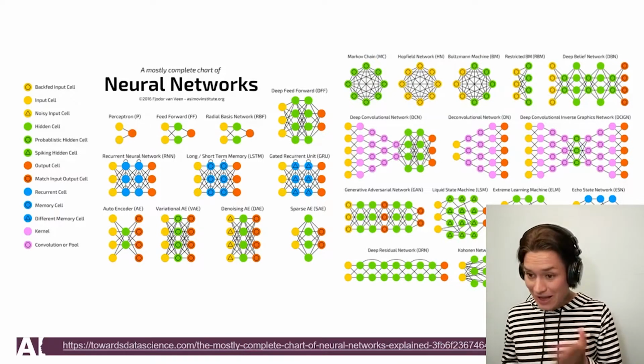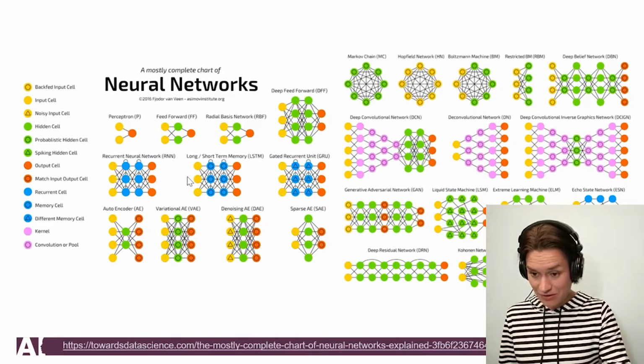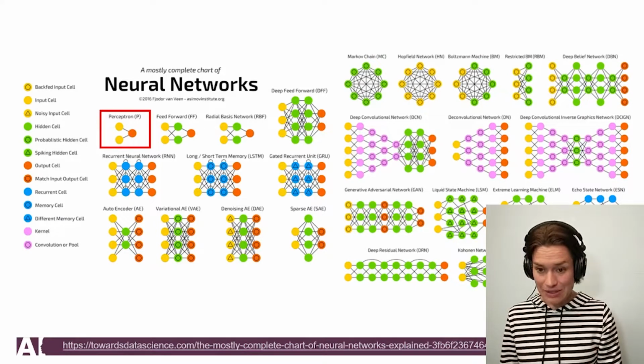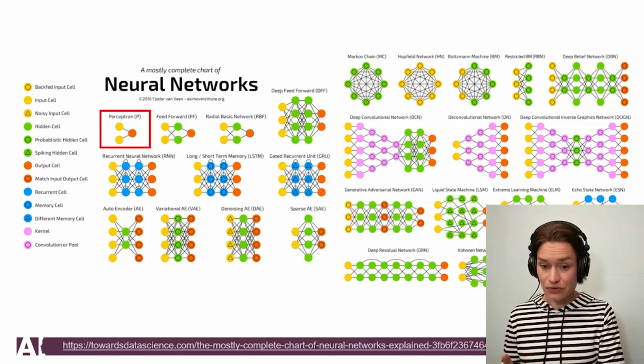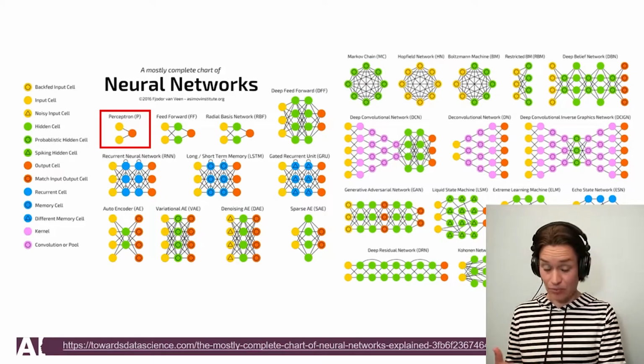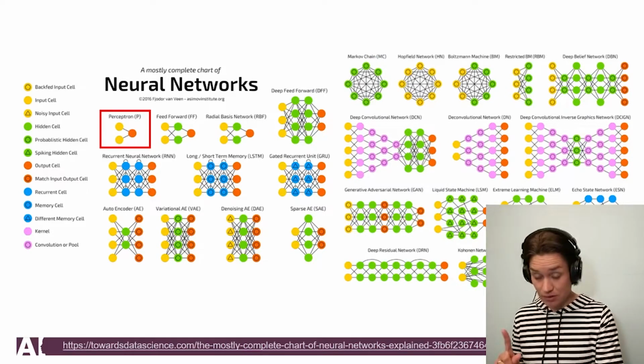Then they have the lines crossing from one dot to another, and sometimes they cross more than in others. And they have this little guy, the perceptron, as a common element. There are common elements for different neural networks, but there are different architectures to tackle different problems in computer vision. And we're going to talk about it later.